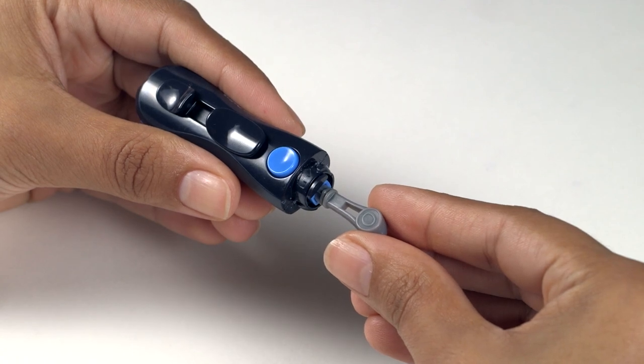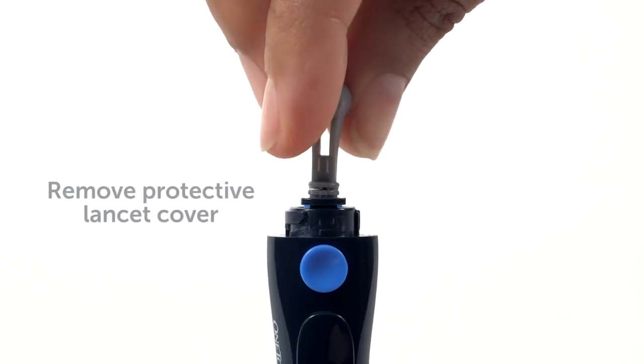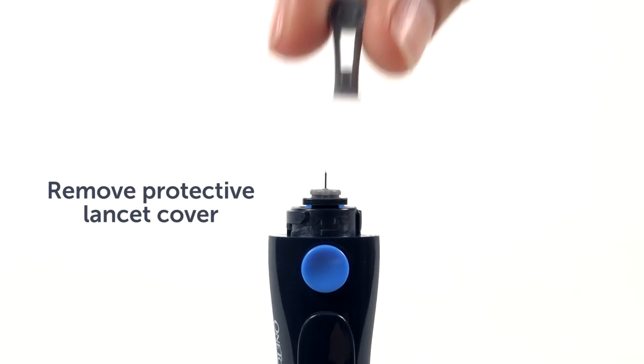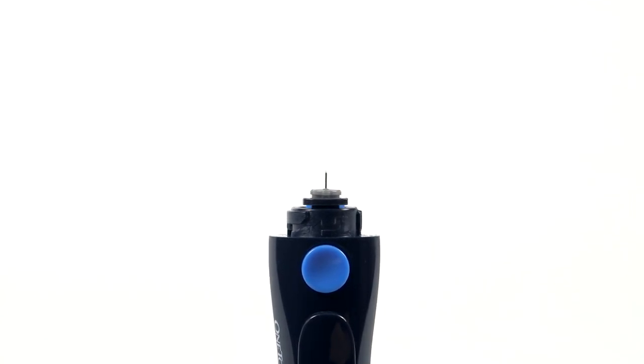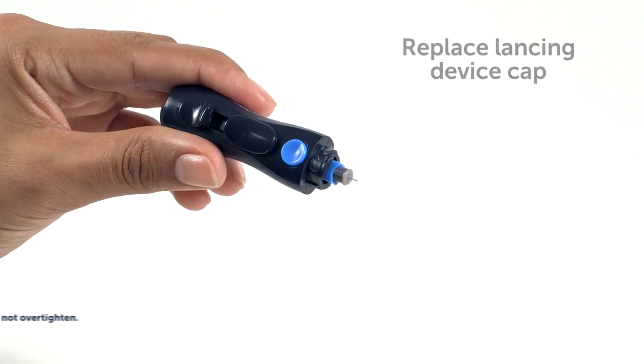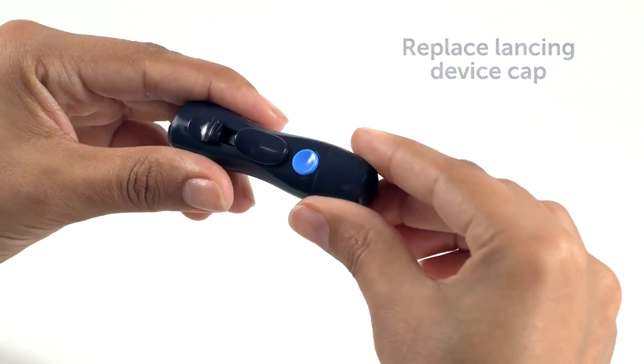Remember to use a new sterile lancet each time you obtain a blood sample. This will help prevent infection and reduce pain. OneTouch Delica lancets are available in two sizes: 30-gauge fine lancets and 33-gauge extra-fine lancets. Twist the protective cover one full turn until it separates from the lancet. Save the protective cover for lancet removal and disposal. Place the cap back onto the device.